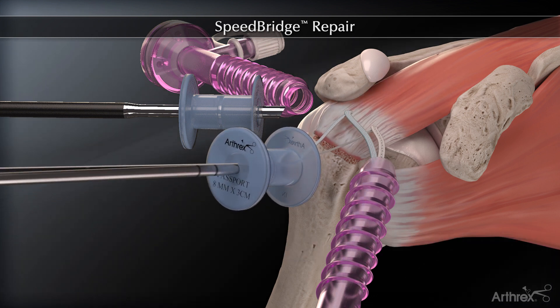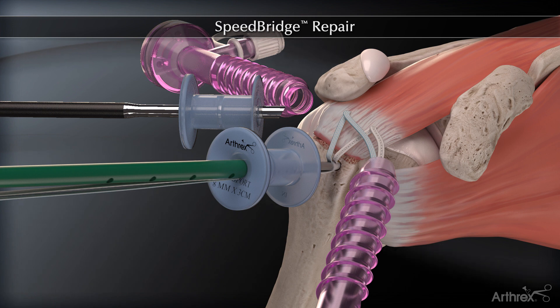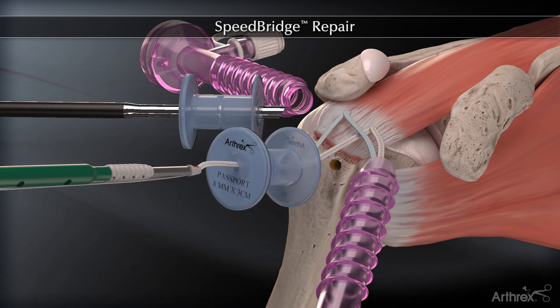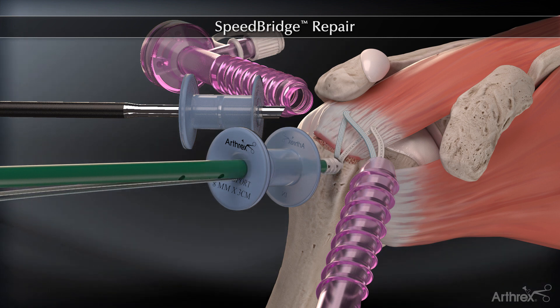Prepare a lateral bone socket. Tension the fiber tapes and then insert the eyelet into the bone socket. Do not attempt to apply tension with the eyelet in the bone socket. If it is determined that the tension is not adequate, the driver can be backed out and tension readjusted. Insert the cannulated and vented biocomposite swivel lock anchor.